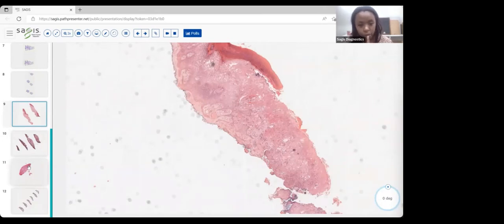Well, actually, before we do that, one comment I want to make, and I just want you to keep in mind again this kind of stranding that we've looked at, as characteristic of the pox viruses.